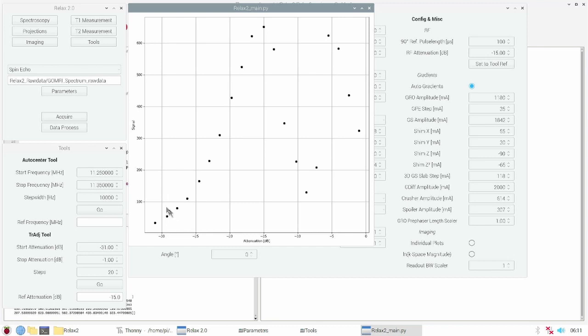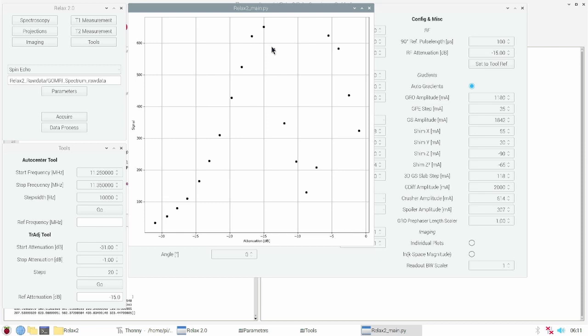With high attenuation, so small RF pulses, only small signal gets acquired. With higher flip angle and higher pulses we get to the first maxima. This is the 90 and 180 degree condition.